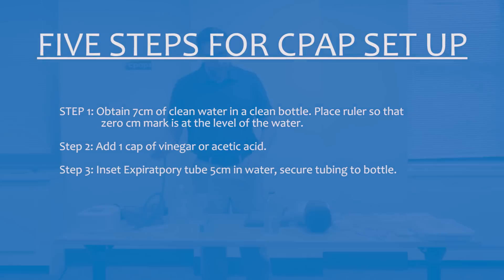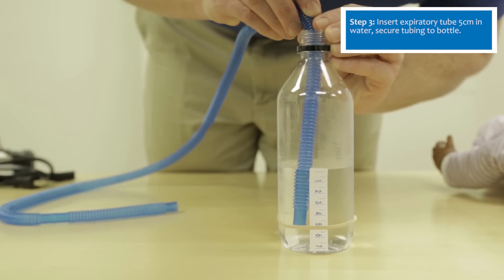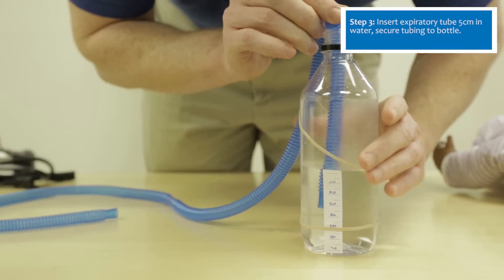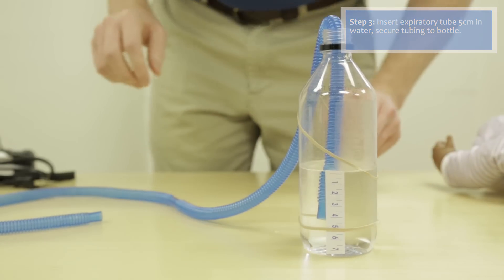The next step is to place the expiratory tubing 5 centimeters into the water. Secure the tubing by using a rubber band around the tubing and the bottle. Ideally the tubing is at 5 centimeters, but anywhere between 4 and 6 centimeters is acceptable.